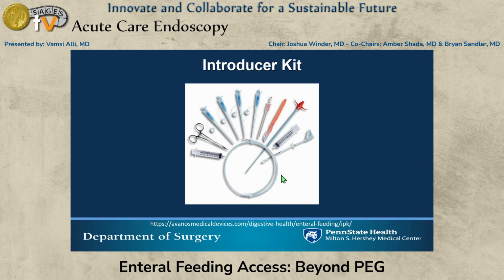So the introducer kits contain everything that you need, including the introducer, guide wire, and puncture needle, and they also involve a stoma measuring device so that you know the exact length in case you wanted to go to a low-profile system immediately.